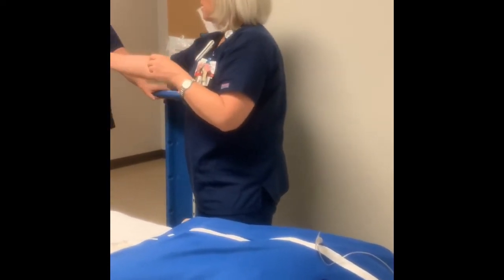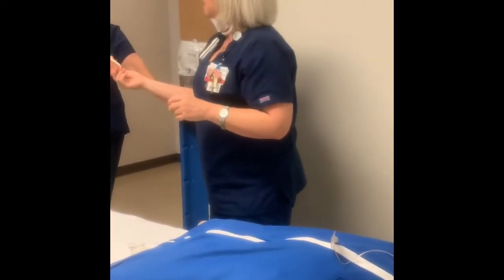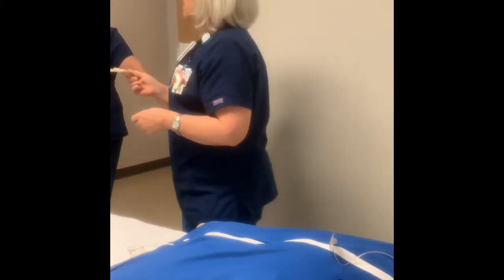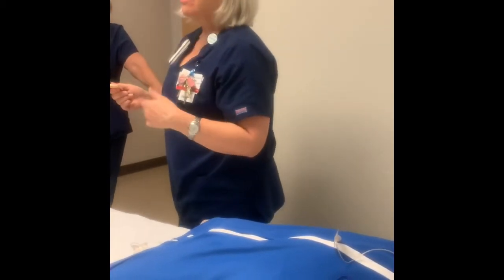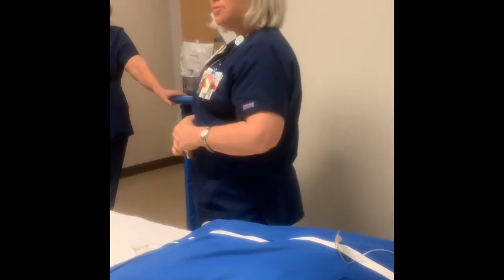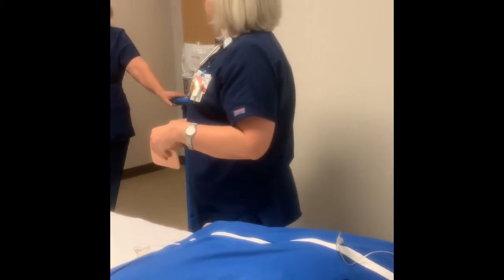They seem thick. We have drain sponges that already come cut. They're clean gauze, and you don't have the problem with strain. This seems thick though. It's not thick at all. And we use them all the time at Gateway, and they've really decreased our pressure ulcer rate. These things are amazing. We use them on the peg tubes too, because they're great bolsters, and they prevent that excoriation underneath there.